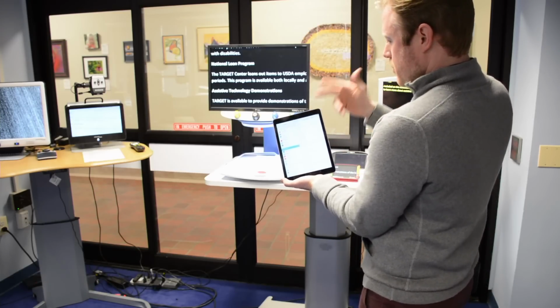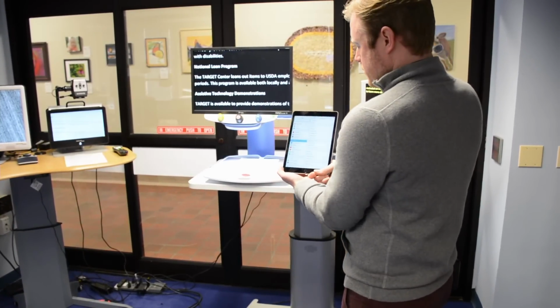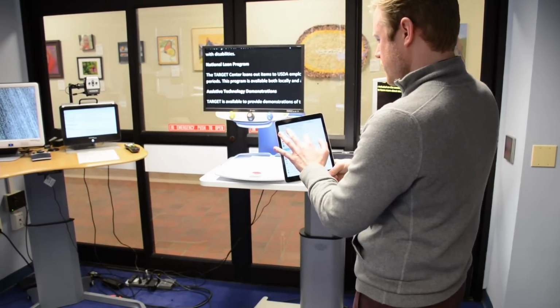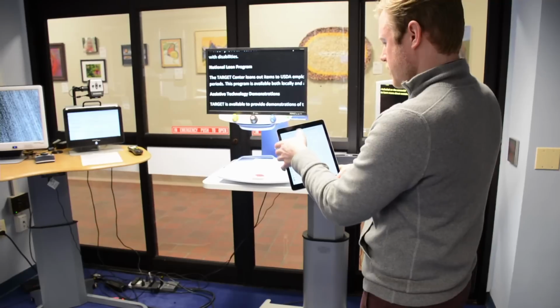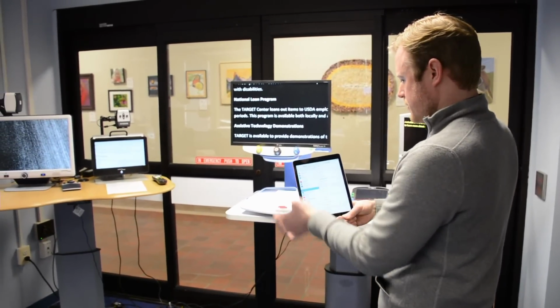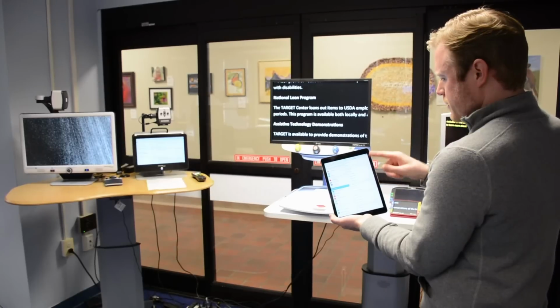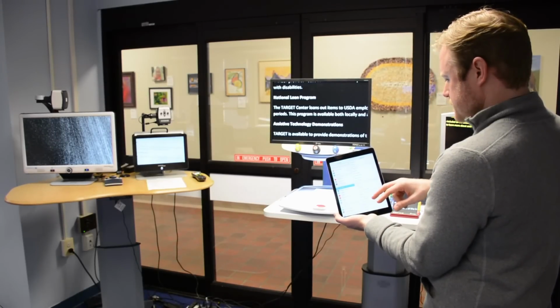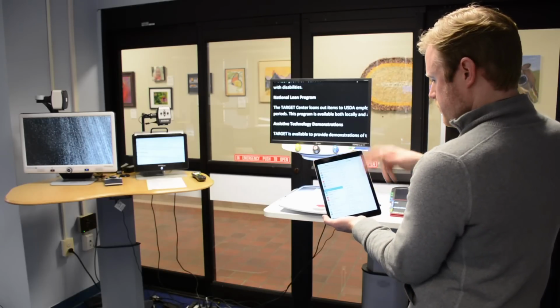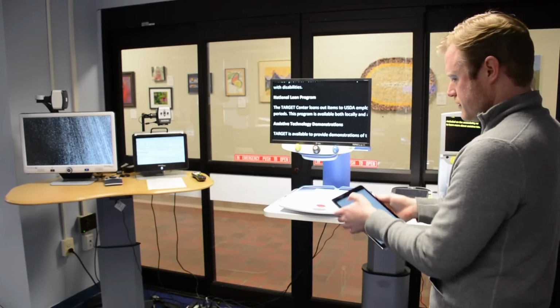They have large text, bold text. You can add shapes to the buttons on the screen, so it's easier to identify. The text would obviously help with reading. You can increase the contrast of the screen, darken the colors, reduce the white so it's not as bright in your face. And all this functionality is on the newer operating system for any of the iPhones as well. So those are all the visual functionality features of iPads and iPhones.